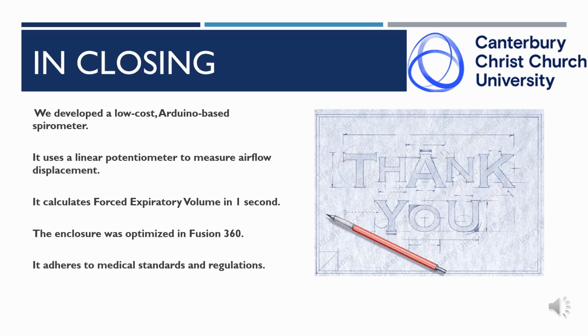As we wrap up, let's reflect on the significance of this project. The development of an Arduino-based spirometer represents an important step towards increasing access to respiratory health monitoring. By utilizing affordable and widely available components, we have created a device that is not only cost-effective, but also accurate, reliable, and easy to use. With clinical validation and regulatory approval, this spirometer could be deployed in hospitals, clinics, and even personal home care settings, helping millions of patients monitor their lung health more efficiently.